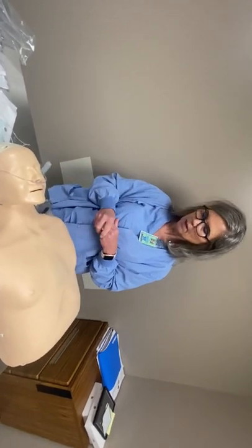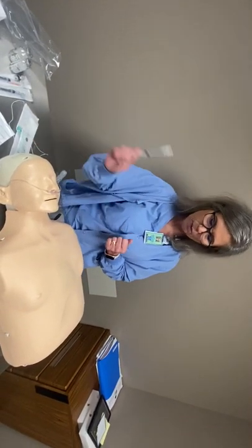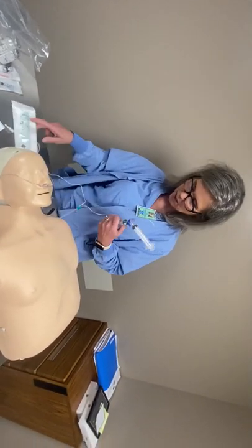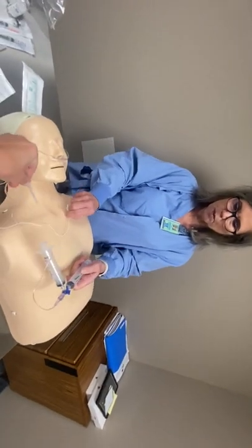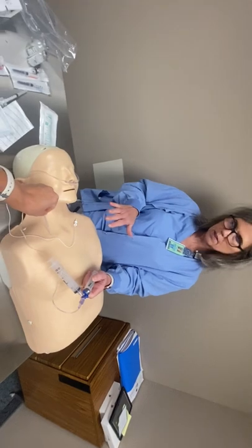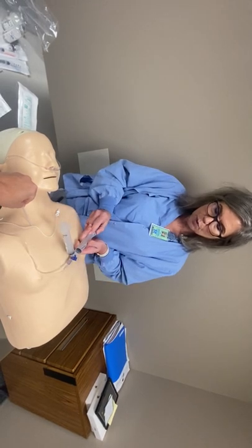They will scan the patient's body to find the nerve on the ultrasound screen. Once they've found the perfect spot, hand them the local anesthetic — they'll localize the skin. Once they've localized the skin, hand them the needle and they will perform the block. If you happen to be using a nerve stimulator, watch for a twitch — some doctors use a stimulator and some don't. They will tell you when it's time to inject.